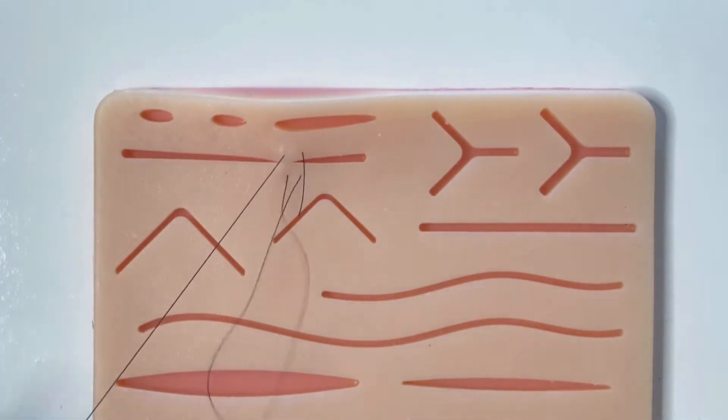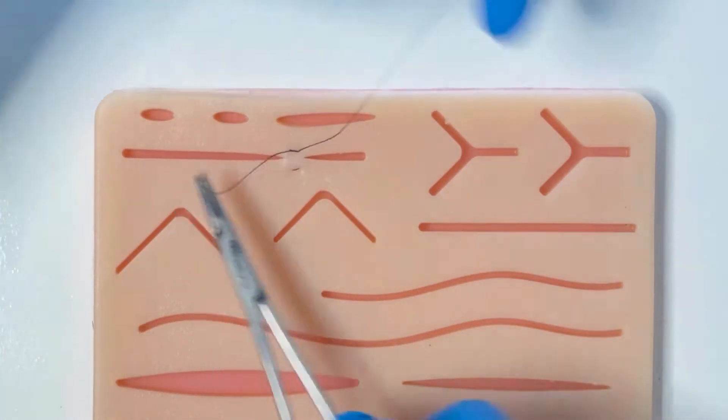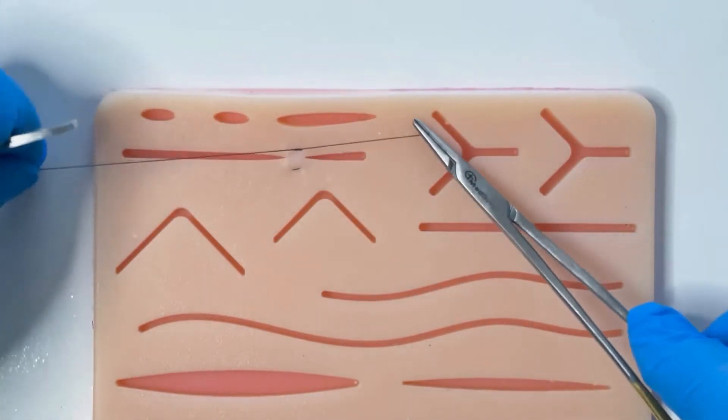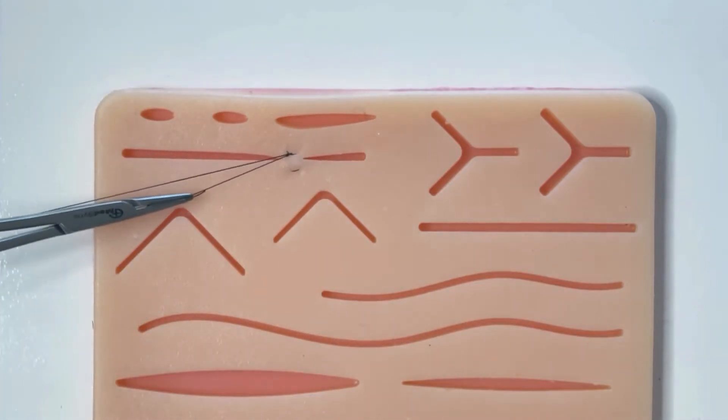This technique is good for wound eversion and can also be helpful for eliminating some tension. See our full video on mattress suturing for more detail.